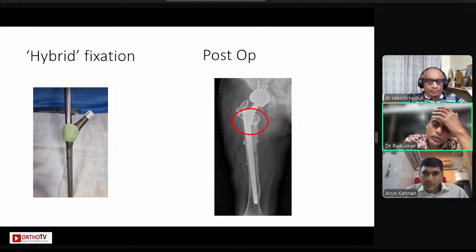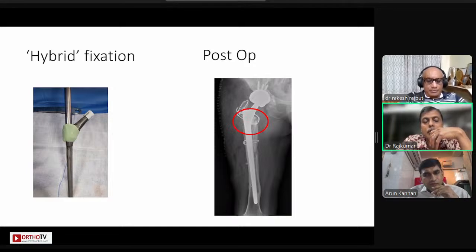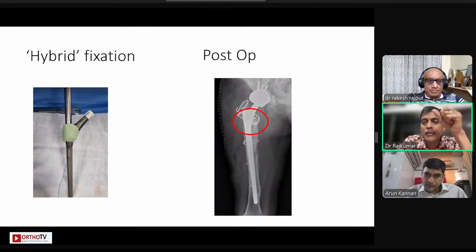The reported subsidence depends on the Wagner splines, the stem profile and the taper, everything put together; it has a good incidence of subsidence. But at the end, rigid fixation is what matters when it comes to subsidence. I've seen cases where on the table we sometimes think it is a line-to-line reamer, but in the majority of cases it is not the same. So it all narrows down to the preparation. First point.